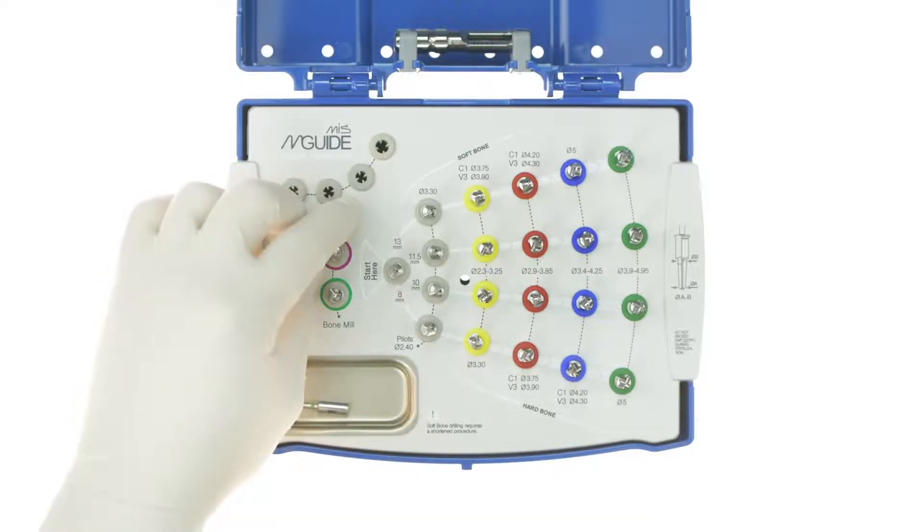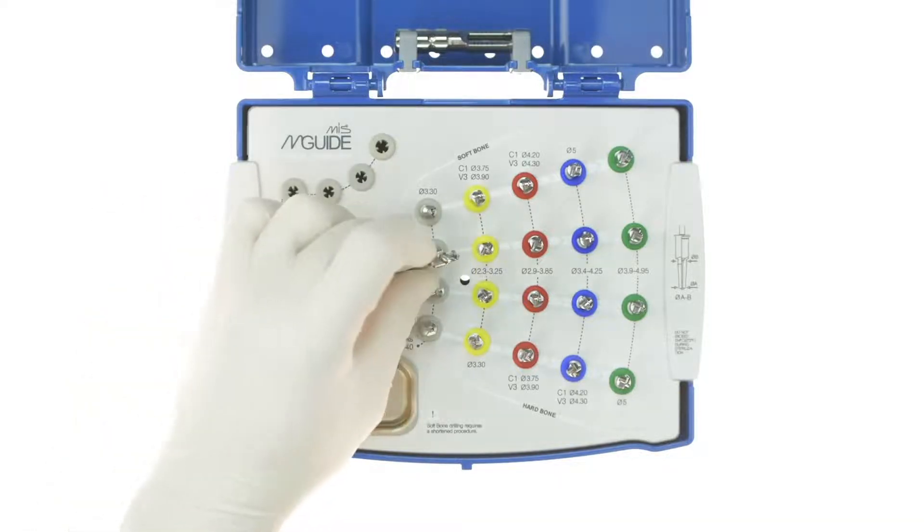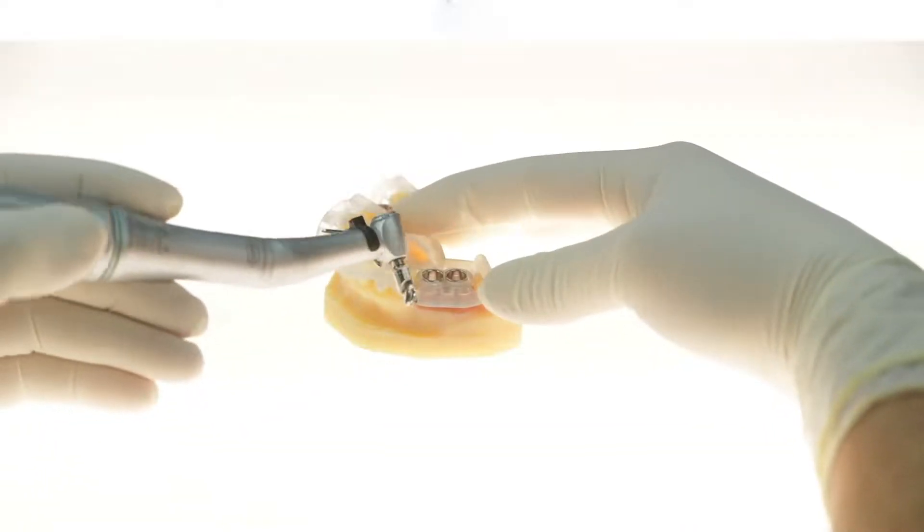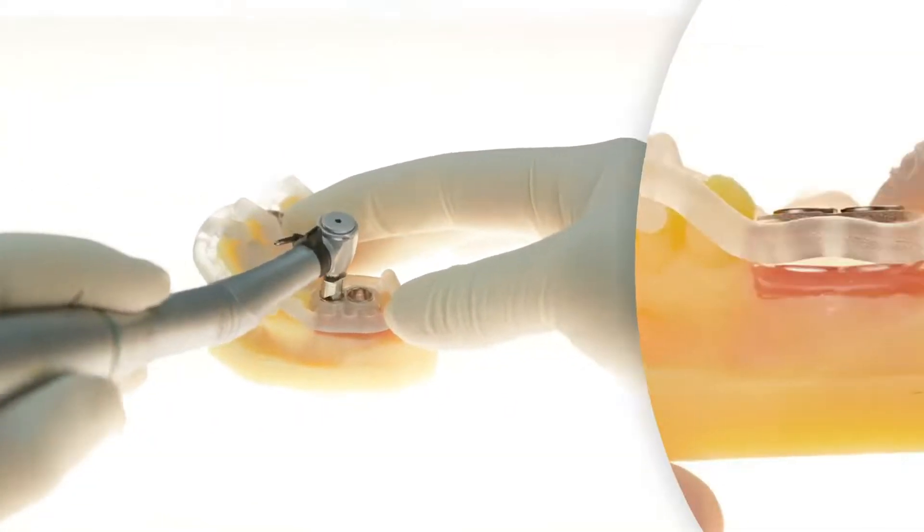Following the tissue punch, a bone mill may be used to flatten an uneven ridge. It only removes bone to the level of where the top of the pre-planned implant will end up.